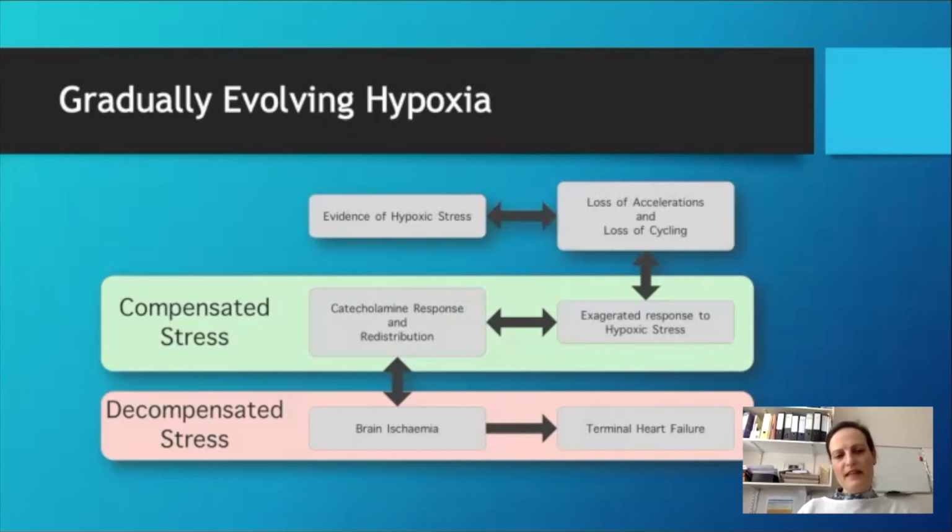And that's why STAN is important. We want to use it first for physiology, because we want to work to avoid STAN events. But sometimes in the very late stages of labor, to allow a normal delivery or less intervention, we can trust STAN to go into this gray area that to the naked eye looks like there are some signs of decompensation, but that baby is still fine.